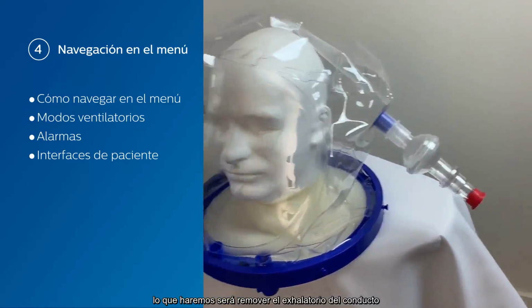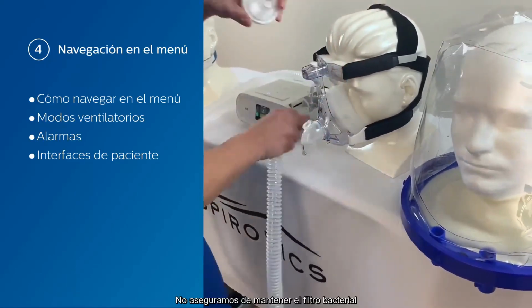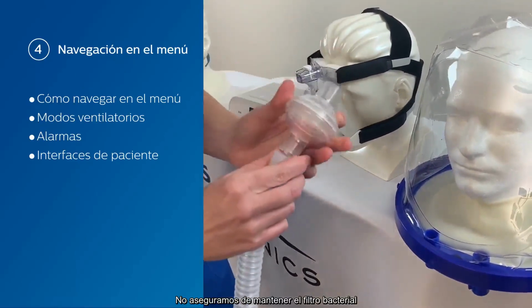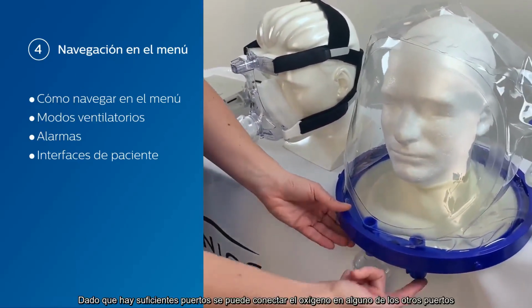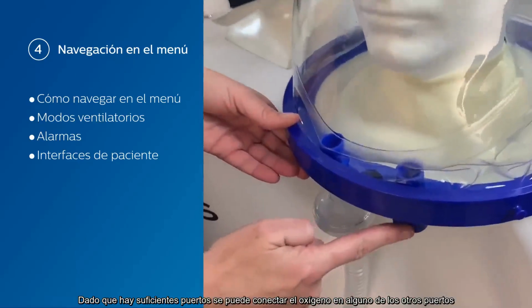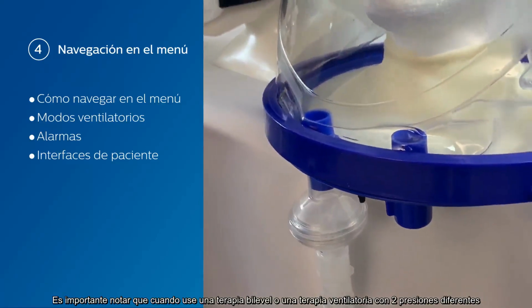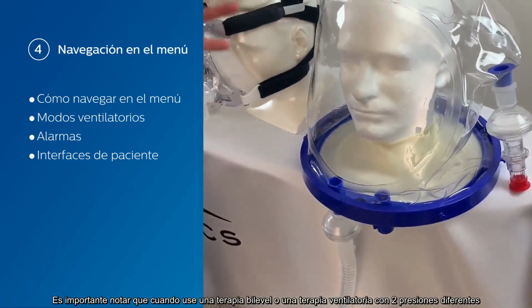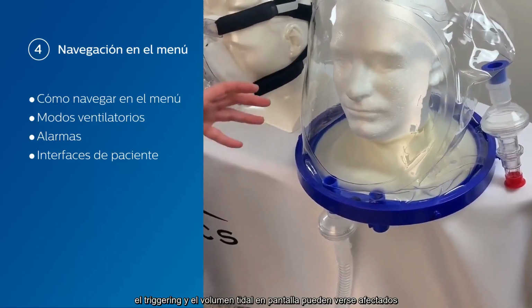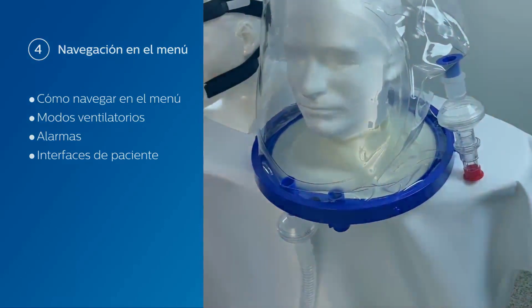cap. What we're going to do is remove the exhalation from the tubing. We're going to make sure that we keep our bacterial filter, and we can connect that underneath here. Since there are so many ports, you have the ability to insert your oxygen in one of these other ports. It's important to note when you're using a bi-level or ventilator type therapy where you have 2 different pressures, the triggering and the tidal volume on the screen may be affected.